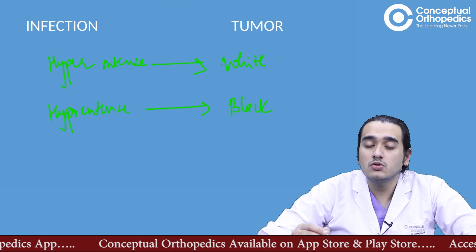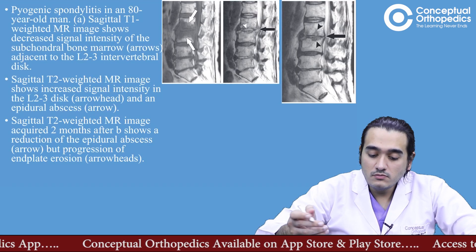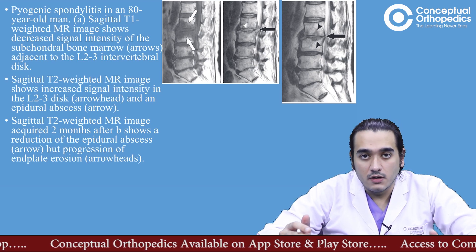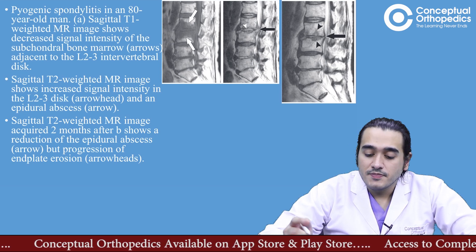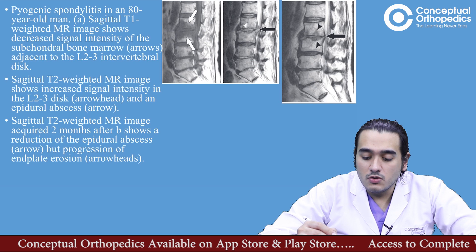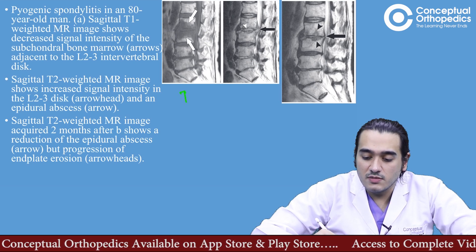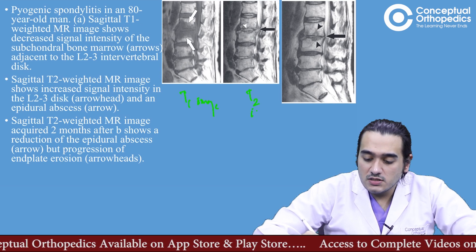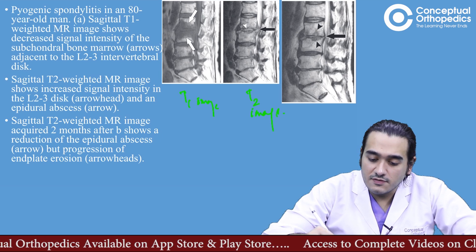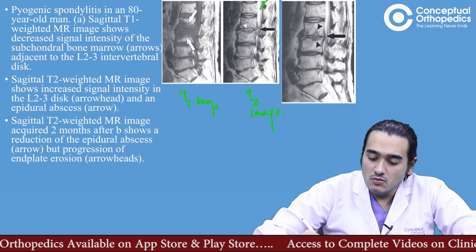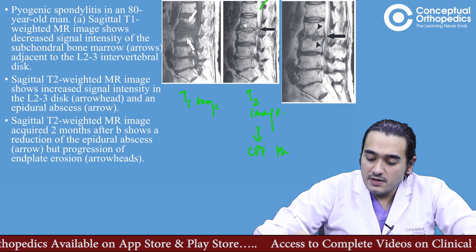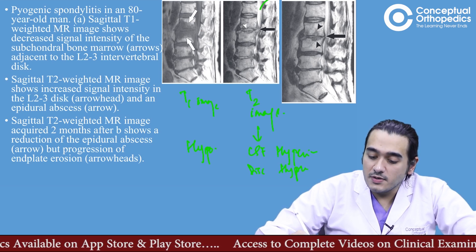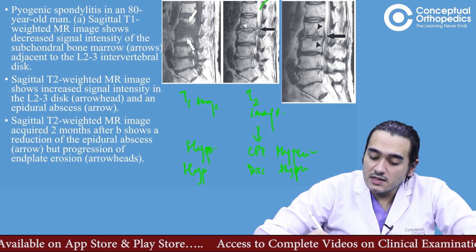Now these are the images of infection — I am telling you upfront — but why exactly is this an infection? When this MRI is put to you, first understand that the first image is a T1 image and the second is a T2 image. How do we know? Look at the intensity of CSF: the CSF in T2 is hyperintense and hypointense in T1. Along with that, the disc spaces look hyperintense in T2 and hypointense in T1.